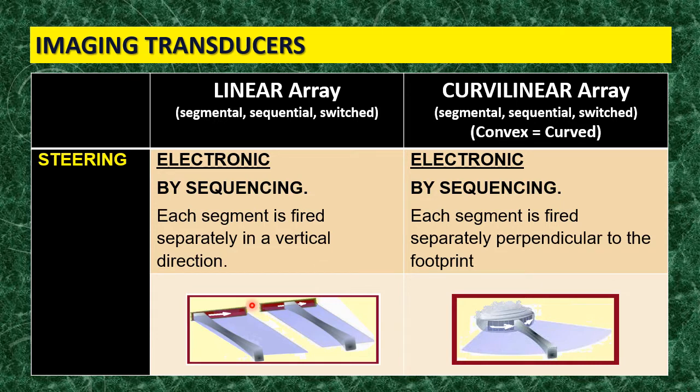All right. So scan lines are sometimes produced in some transducers by what we call overlapping. For example, active elements number 1 till 10 will get the first scan line, and then number 5 till 15 will get another scan line. So there is some pattern of overlapping. It's not important to know this fact, but it is just to increase the number of scan lines. So sometimes the active elements overlap in their pattern of switching. Anyway, this is called segmental or switching or sequential.